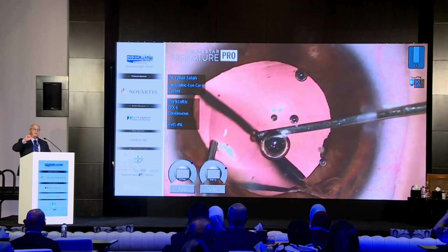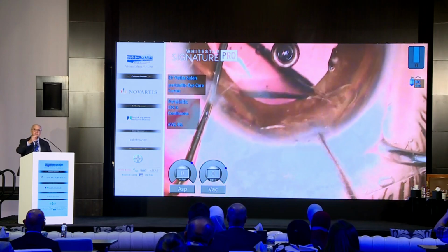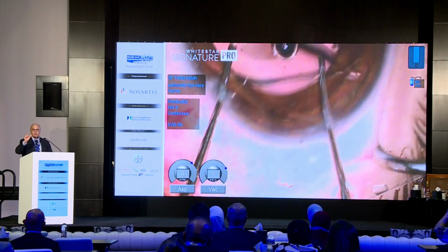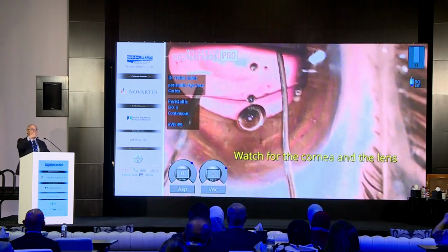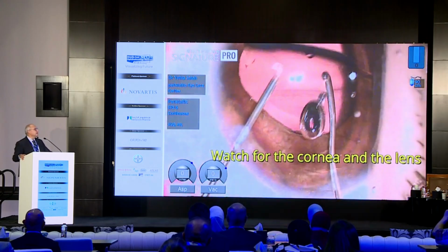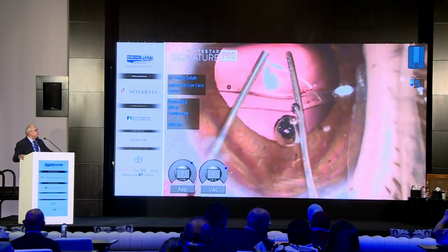Remember, there is the IPCL, which is the Indian type. It's made of a different material. You cannot do this. Just a warning. In an IPCL, you have to get it out. With this polymer material, you can do this flipping inside of the eye.